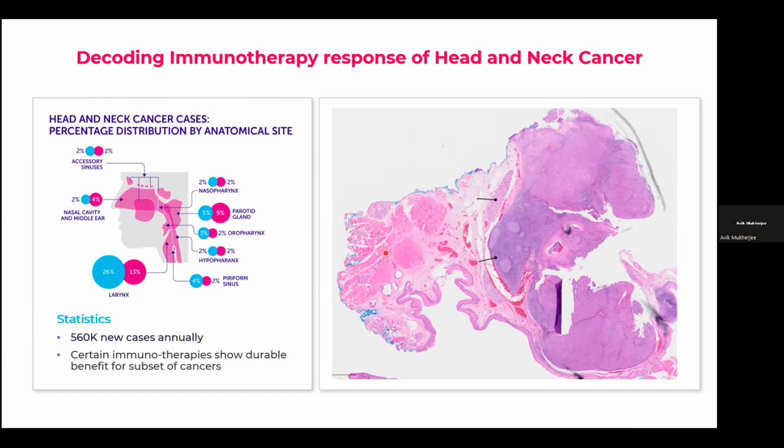And I always feel when you look at the H&E image, where you know this is the tumor region, when you do immunofluorescence, I think it doesn't add complexity, it adds more of a value to what you can get more out of that single piece of tissue.